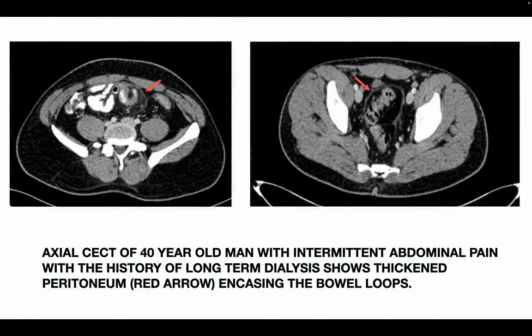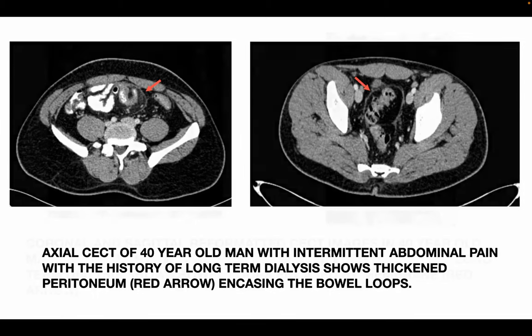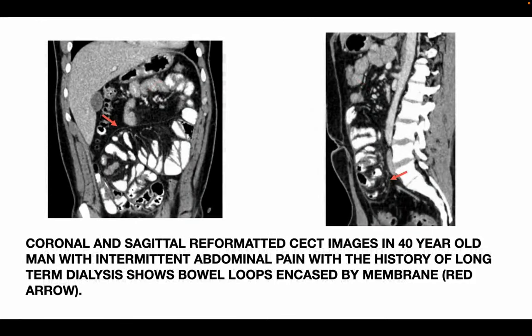This is another case of a 40-year-old man on long-term peritoneal dialysis who presented with a history of intermittent abdominal pain. The axial CCT shows thickened peritoneum (red arrow) encasing the bowel loops. Coronal and sagittal reformatted CCT images of the same patient further demonstrate the bowel loops encased by the fibrotic membrane.